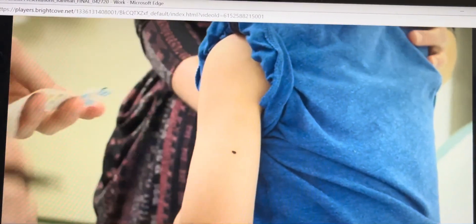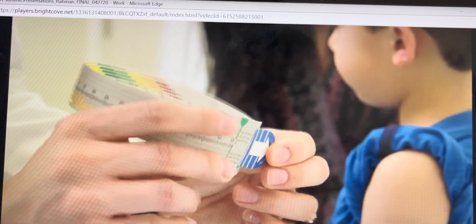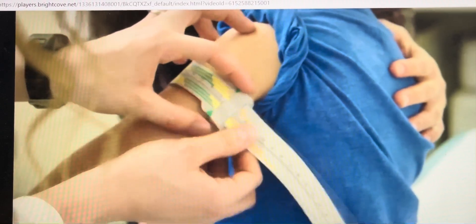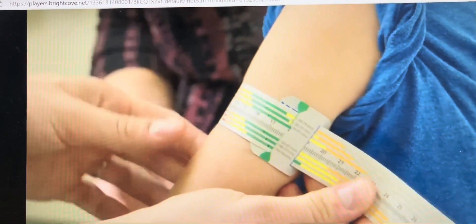Next, have the child relax their arm straight by their side. Slide the loop of the device up to the midpoint. Ensure to fully extend the elbow so that the arm is straight before measuring. Once at the upper arm midpoint, hold the tail end of the tape until it is snug but does not compress the skin. The tension of the tape should not be too snug or too loose.